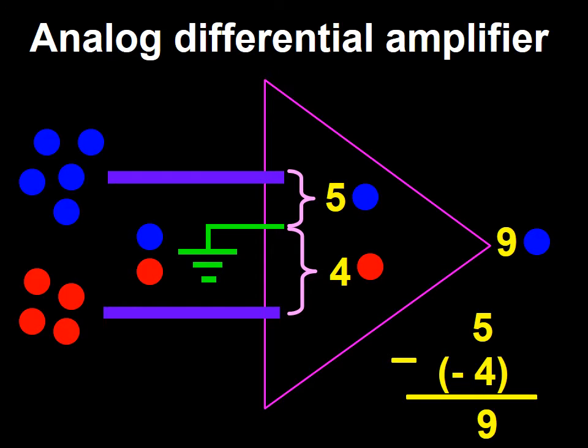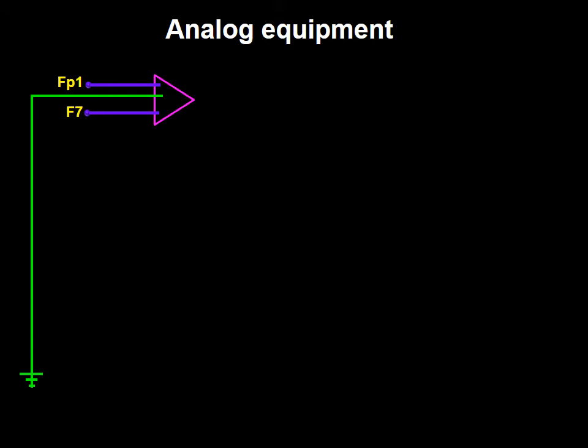I will, in the following frames, label each electrode using the conventional EEG nomenclature. So we are going to make the one on top FP1 and the lower one F7. This new diagram is nothing more than the diagram I have just presented but made smaller.